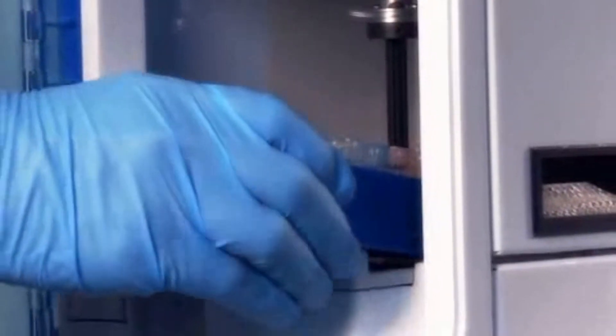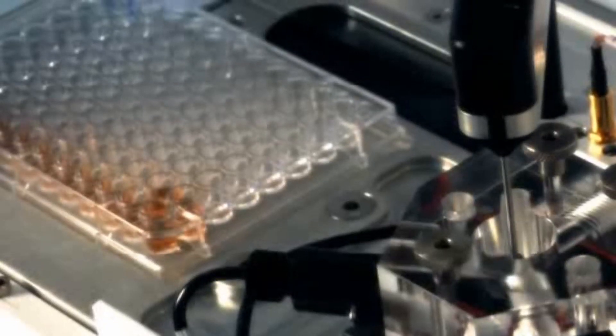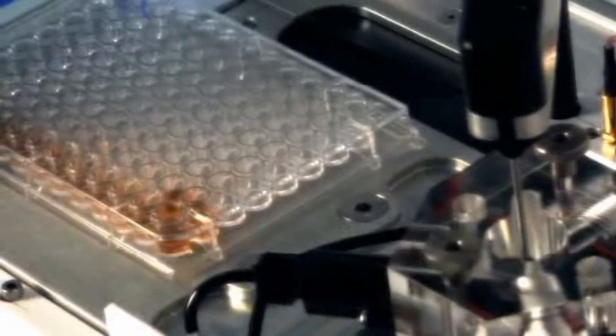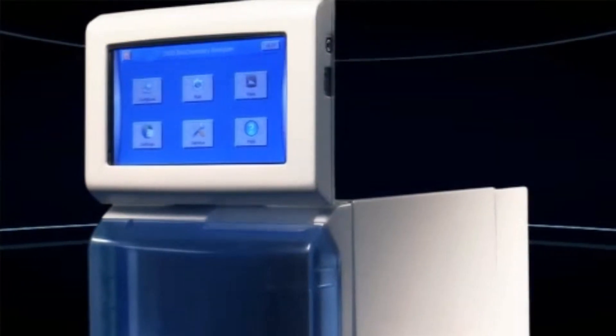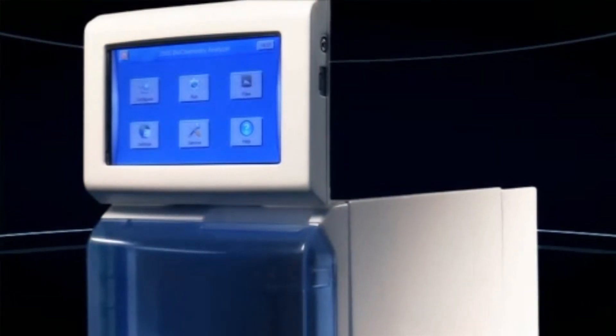Simply place your sample in one of a wide range of vials, tubes, or plates and introduce the holder to the sample compartment of the instrument. With the YSI 2900, automation is included.